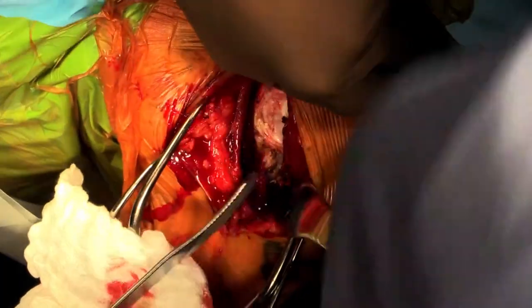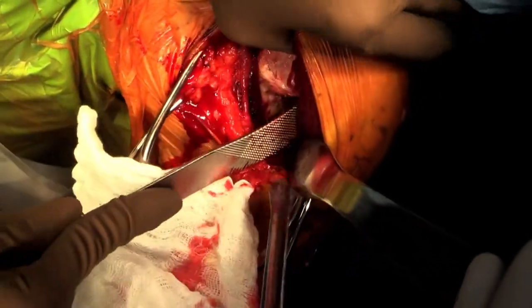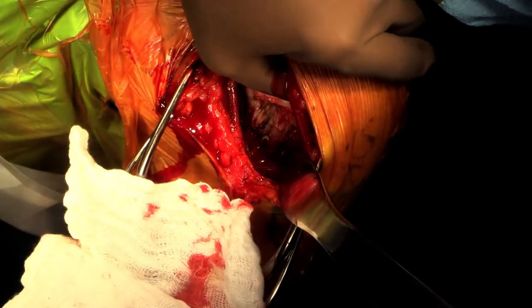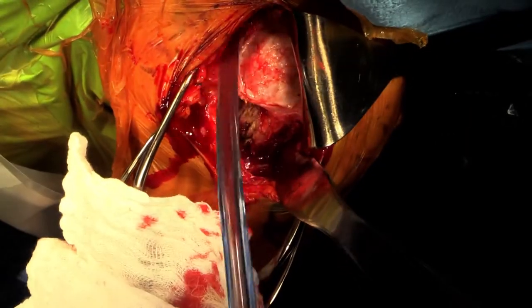Use the Darrach retractor to gently develop the subdeltoid space because the deltoid will need to be retracted. This will make room for the deltoid Browne retractor. Place the deltoid Browne retractor. You can see the bare head in absence of a cuff.